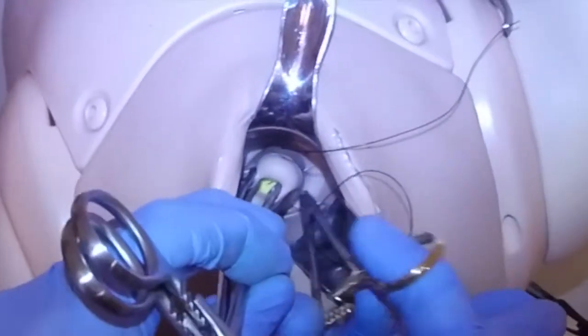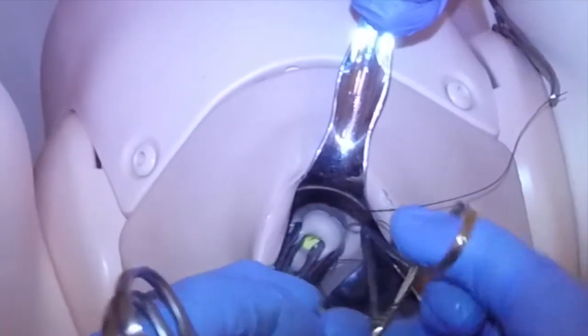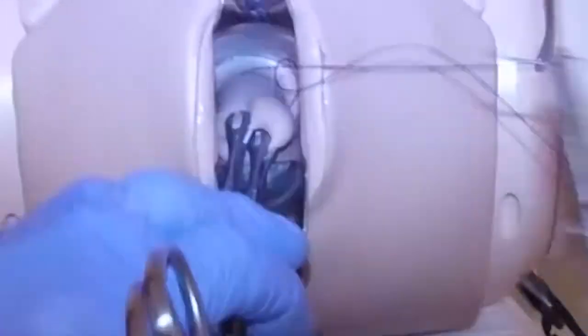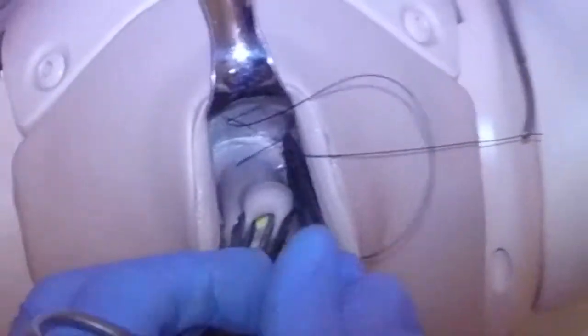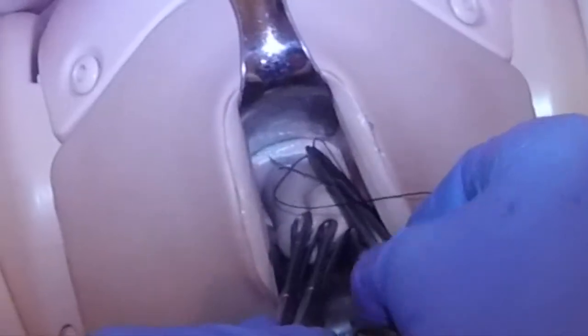Not just grabbing the mucosa, because it slides down. Then my final suture is starting at around two o'clock and coming out quite close to where I first went in. My belief is that the further apart they are, the more it tends to pull my knot apart.